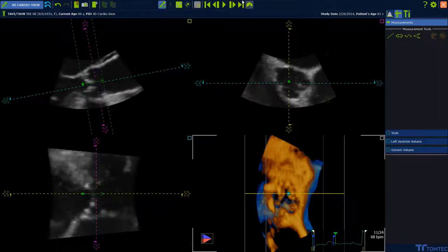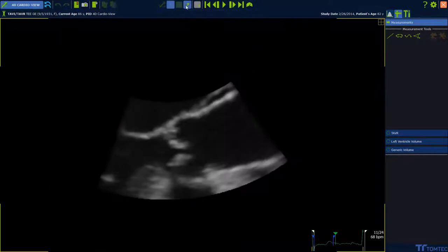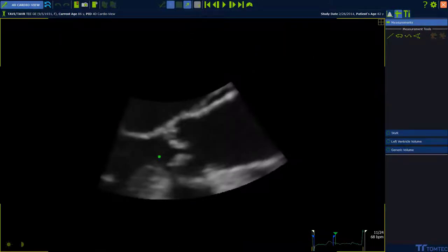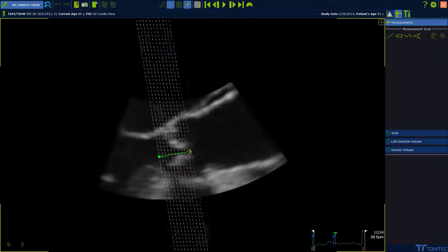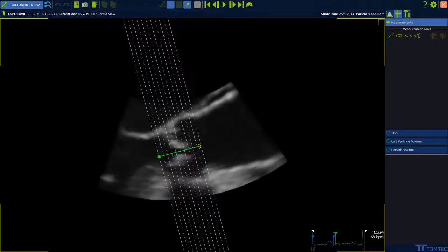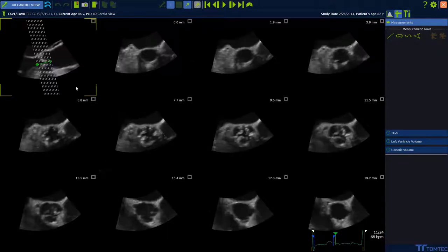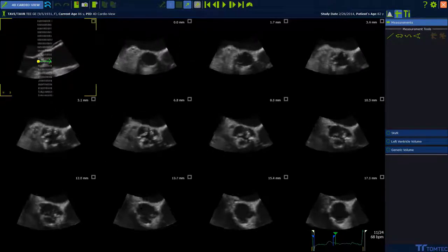How to use multi-slice D-Art. Click on the multi-slice button and set two distance points inside one of the 2D views to define the slicing area. Easily adjust the region of interest by moving the base or tip of the D-Art arrow.